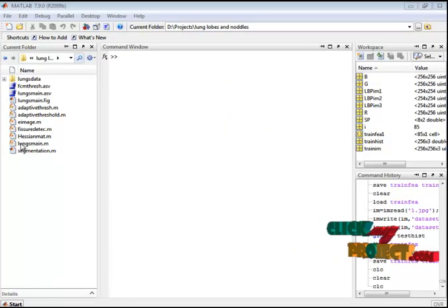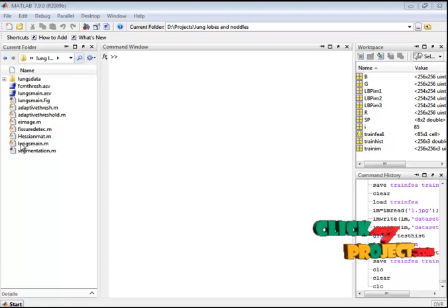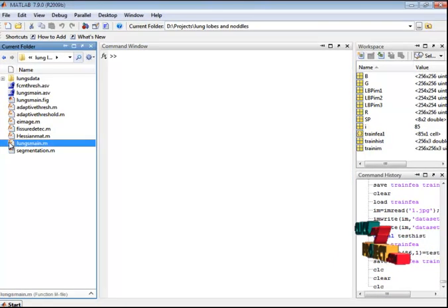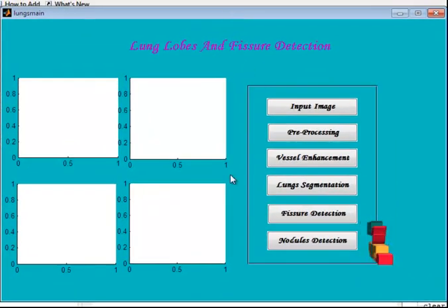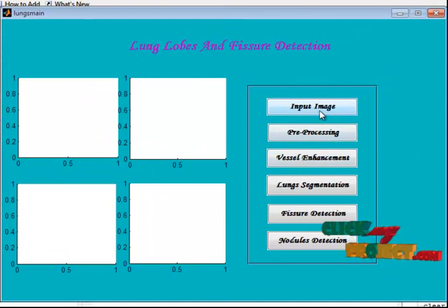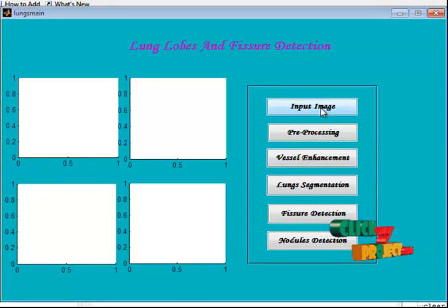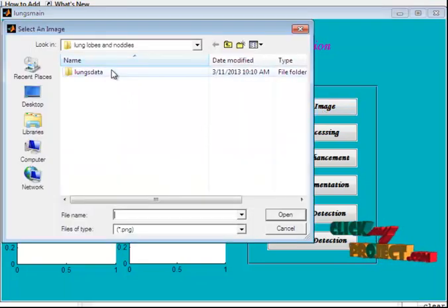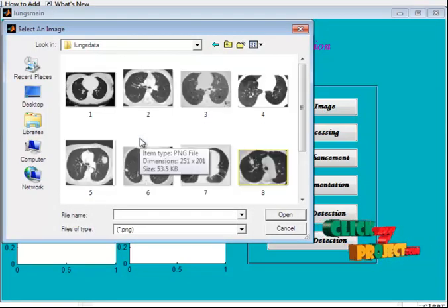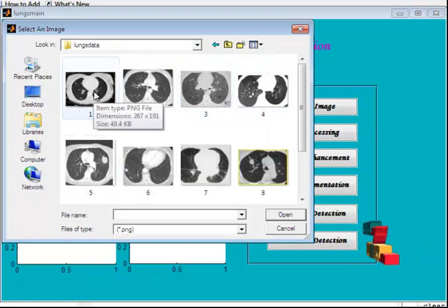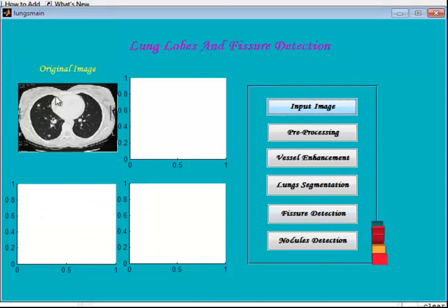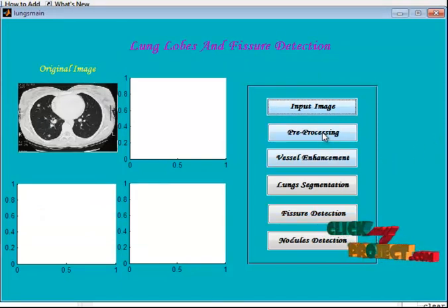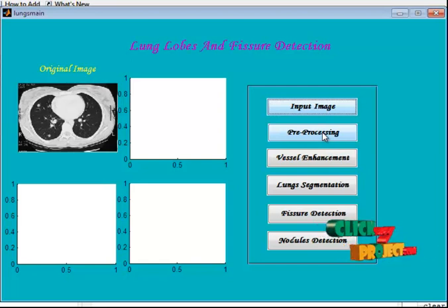Now let's see the execution. Here I have the lungs_main.m file, which is the main file. Select this file, right-click, and run. The GUI window will open — this is the GUI design of the project. In the input image section, we provide any CT lung image. I have a dataset of nine lung images. I am providing one input image, which will display in the first axis. In pre-processing, we remove the noise using the Wiener filter.